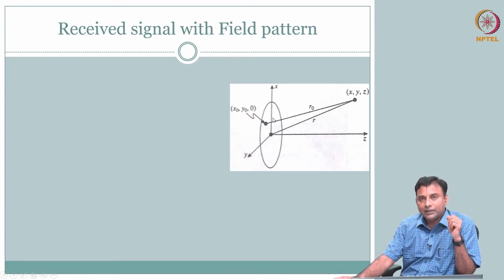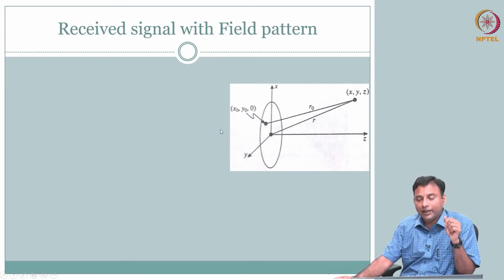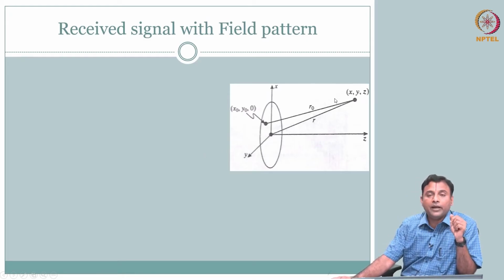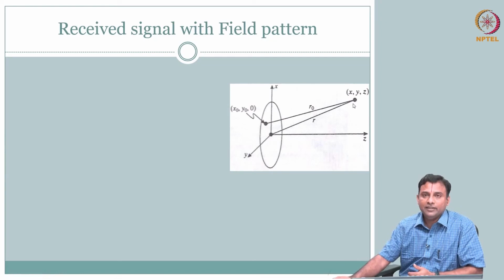When you are going to transmit, all the points are transmitting, not just this point. What happens if we had another point here? That will also behave very similarly, right? The wave would have hit and come back. What if there was a point here? Again, on receive, whatever you are going to get back from the medium, you are going to have a distribution of points, okay?